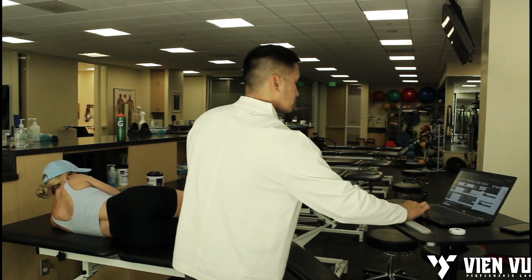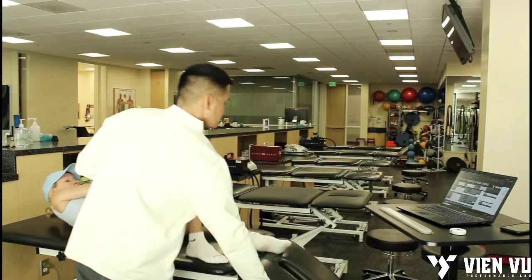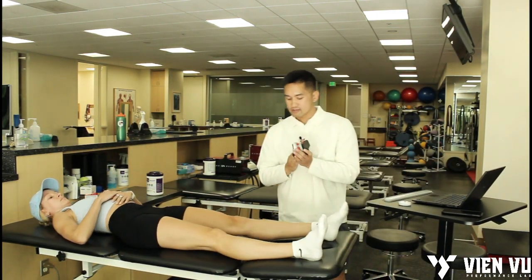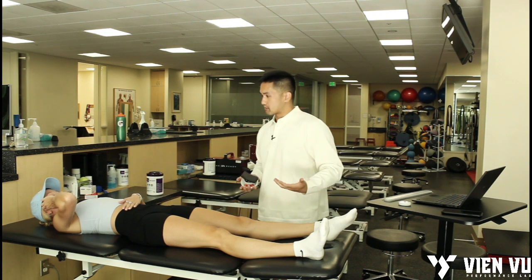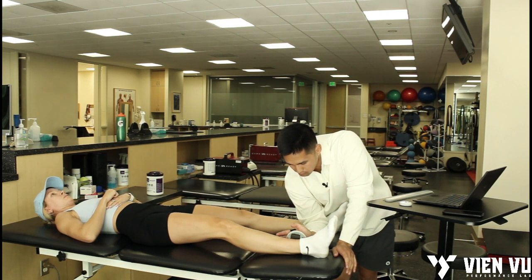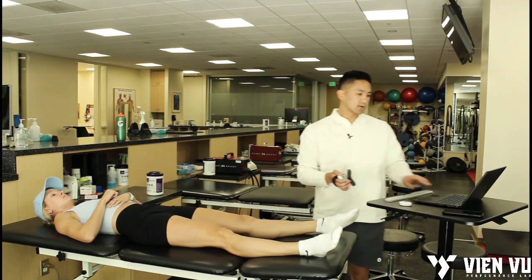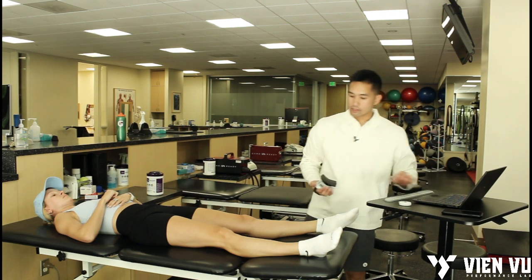From here, have you lay on your back. We're going to do a five-second squeeze test. Stacy, this one's five seconds long — you're going to squeeze both legs together, not just one at a time, and at the end tell me if there's any pain. You can do a gradual buildup; you have five seconds to reach your peak. Ready and go — squeeze, squeeze, squeeze, come on, push, push, push, and rest. How much pain? Good — record two out of ten, then record the force.